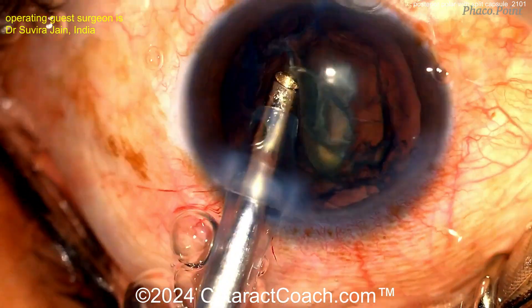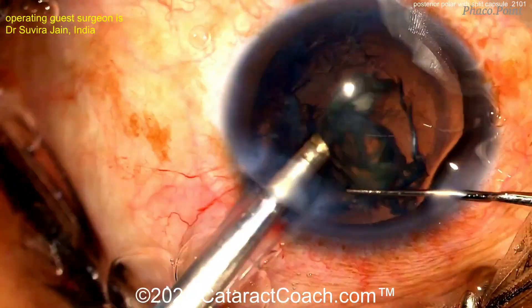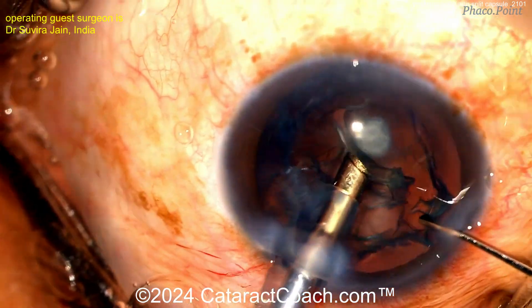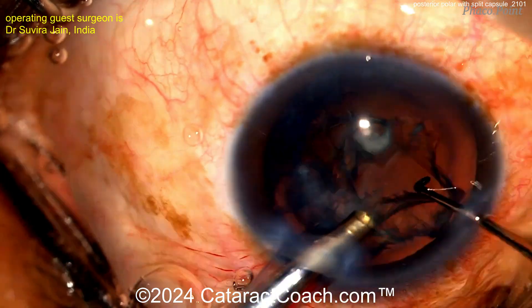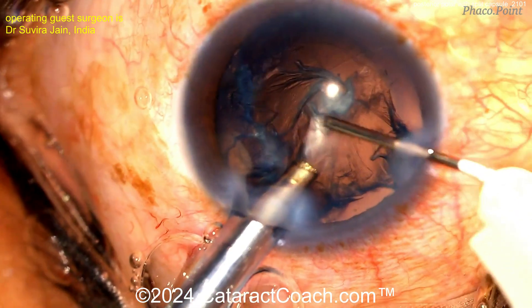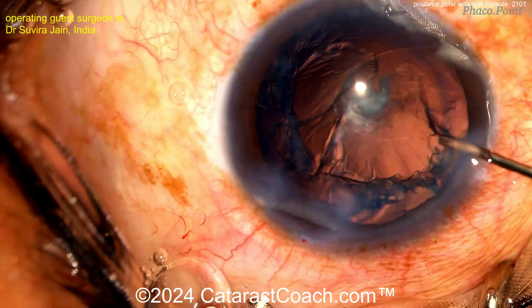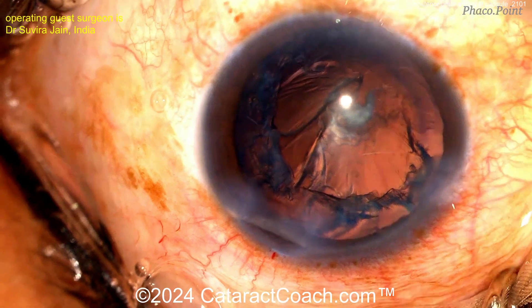Very nicely done — brought that forwards. And now aspirate as much as you can using the phaco probe. Very minimal, if any, energy — you probably don't need any phaco energy, just the vacuum. Get that piece up, and when you get this epinucleus shell up, you'll also get up a lot of the cortex. More viscoelastic. Now you could probably switch to a bimanual IA and clean up all the rest of this. There you can see the remaining epinucleus shell and some cortex.